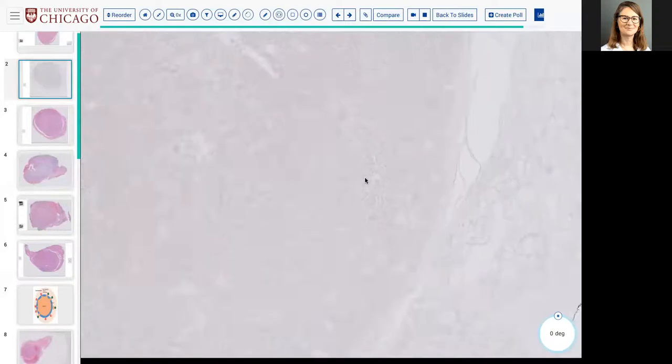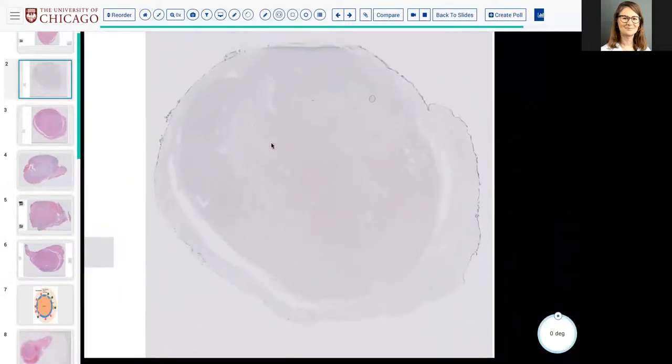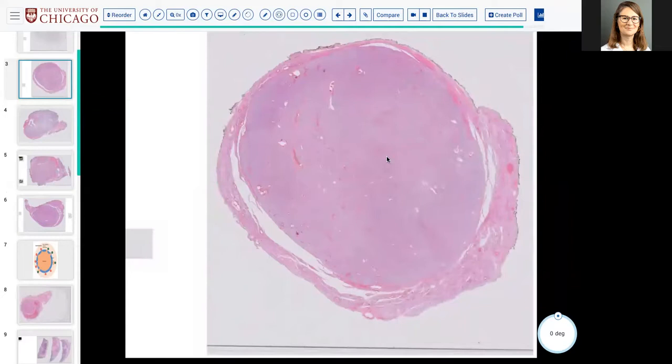in helping interpreting these. And so follicular variant, you know, is a term that's out there. And I do want to comment on that. But before I do, I want to show you an additional section on this tumor. So one of the criteria for NIFT-P, of course, is you cannot make that diagnosis if it has a BRAF V600E mutation. And number two, if you think something is NIFT-P, you really should investigate.